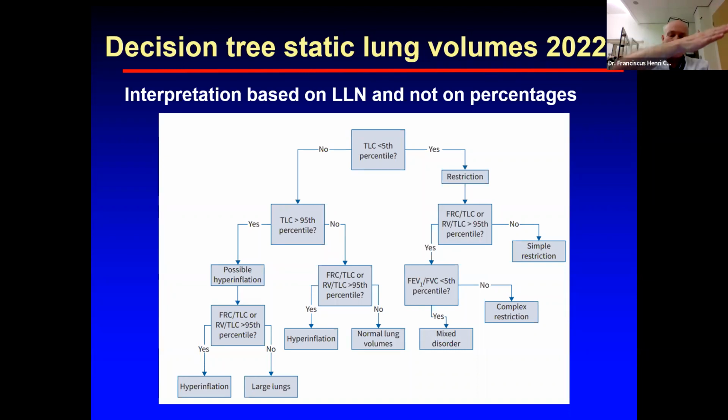But we then look at the details of the graph, the shape of the graph, the forms, which I think Nadia can go to that slide. I cannot from this side at this moment. We do look then if there is a concavity. So, yeah, you're talking about the one that has the pictures, all the eight forms of the flow volume curves. Yep.